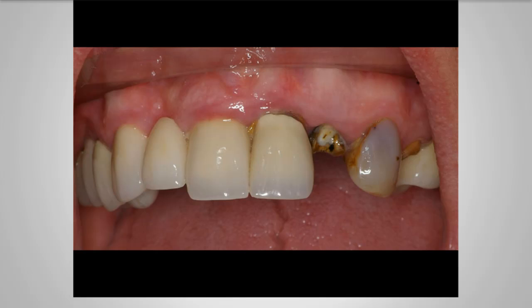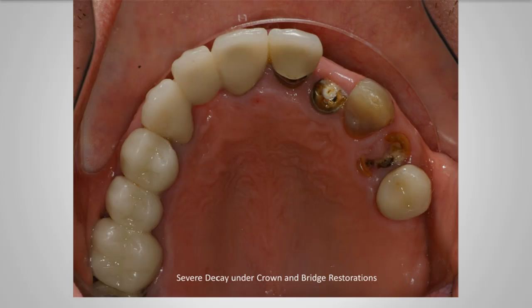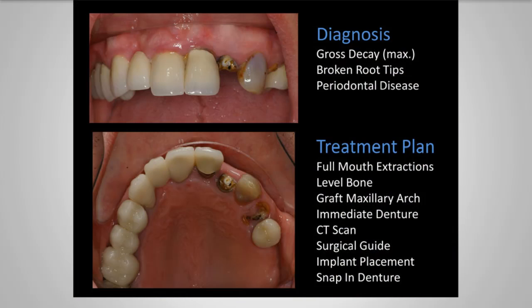Here we have a patient that's dissatisfied with his smile and broken teeth. He actually complained quite a bit of discomfort. Being a truck driver, my concern was that he was taking quite a bit of pain medications with narcotics because of the constant pain he was in. So our goal was to relieve him of any pain and to do so without multiple visits.